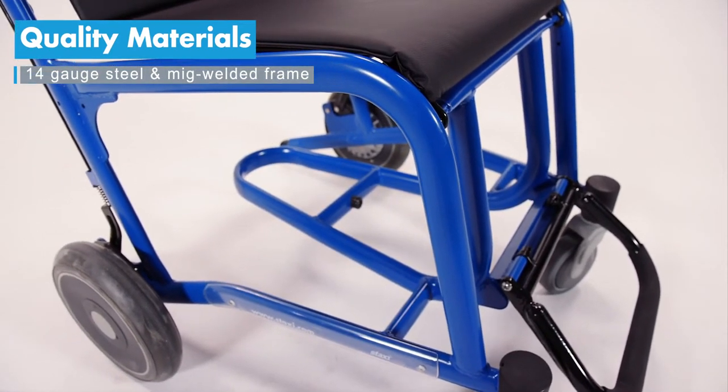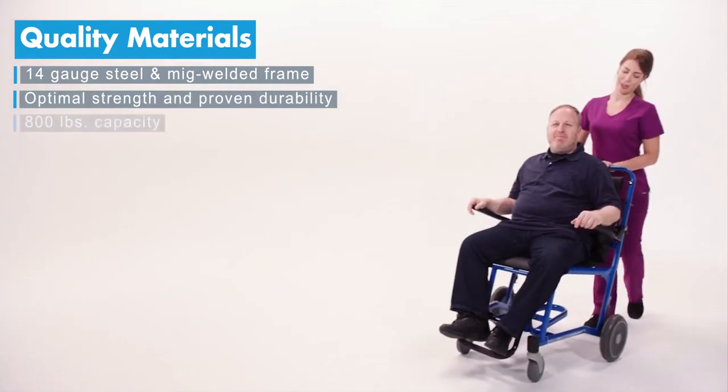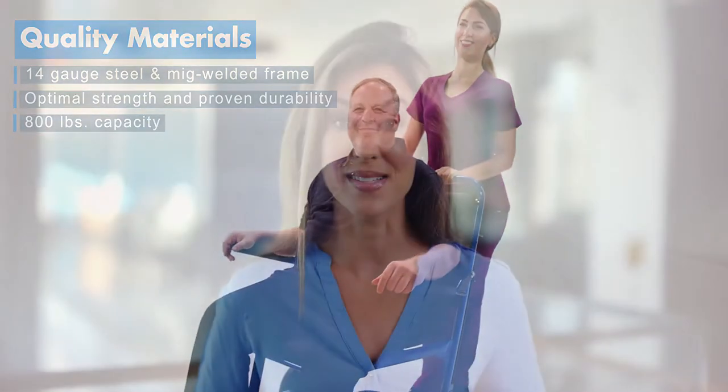So how do we do it? The Ranger is made from 14 gauge steel and the MIG welded frame provides optimal strength and durability, delivering an 800 pound weight capacity.